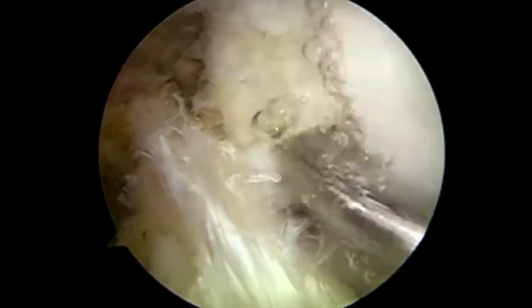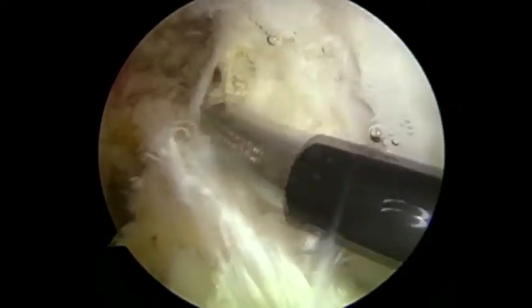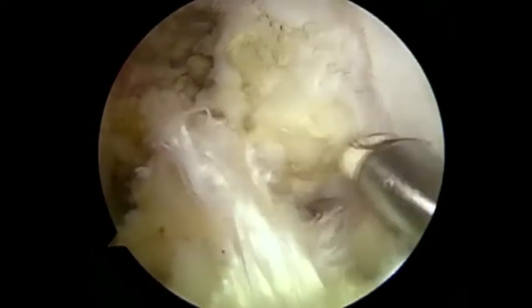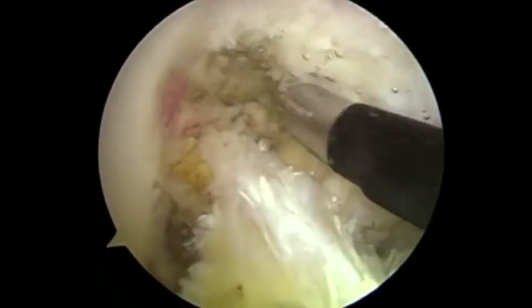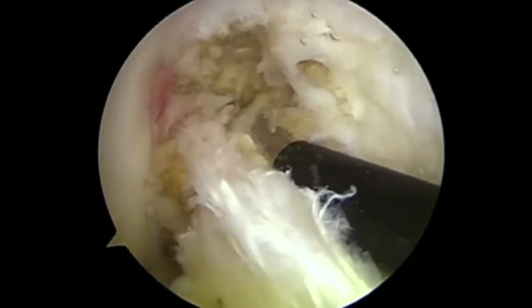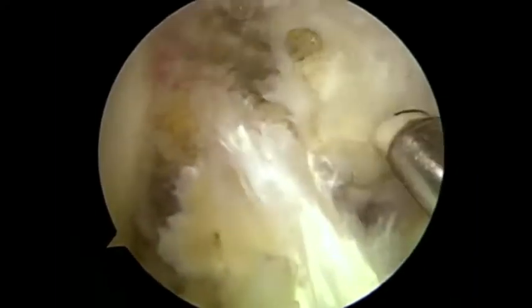Any inflamed synovium over the PCL and ACL should also be removed to physically debulk material in the intercruciate space within the femoral notch. The synovial coverings within the notch around the PCL and the ACL should be removed.